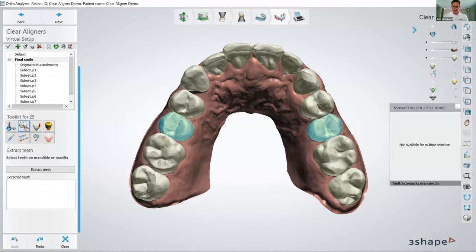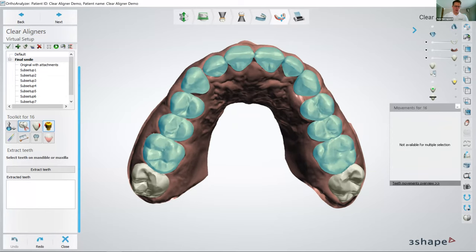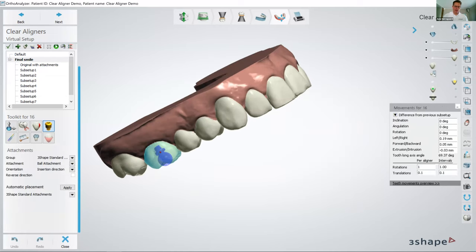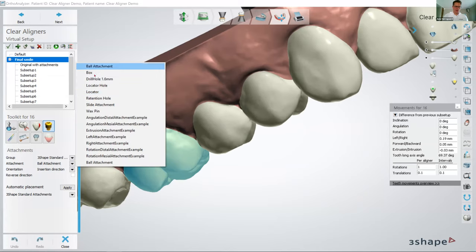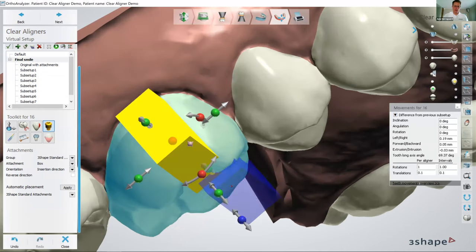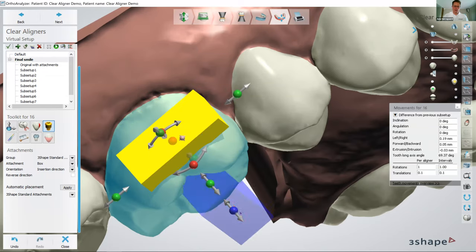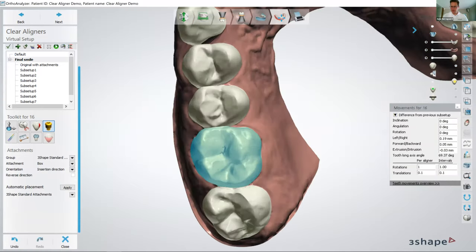I know that I didn't cover the attachment, but I can quickly show you that there is an option that allows you to look at each individual tooth. You can select a tooth, and then you can select some attachments. So you can bring in a box here, and you can place an attachment manually on a tooth, and then you get these control points where you can adjust and move them into the desired position. So you can do manual attachment placement, but you can also try to use the automatic placement functions.